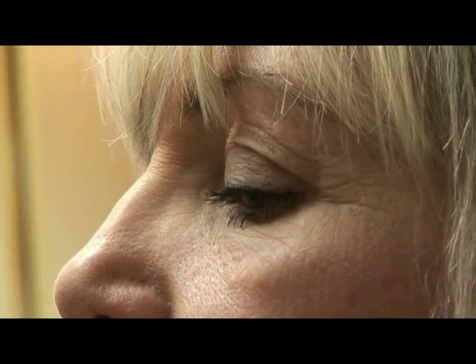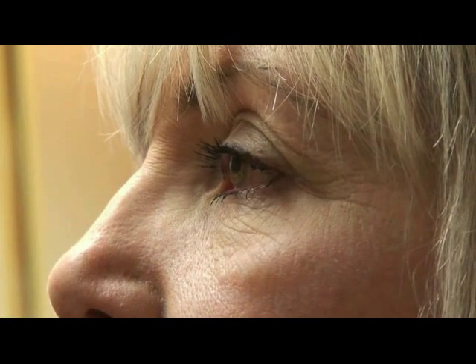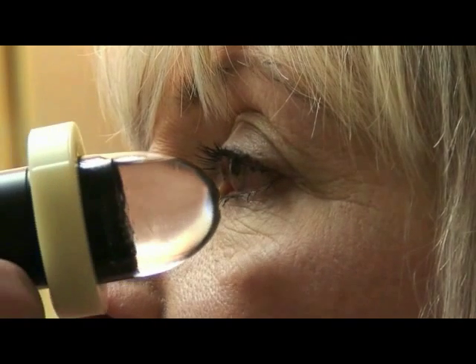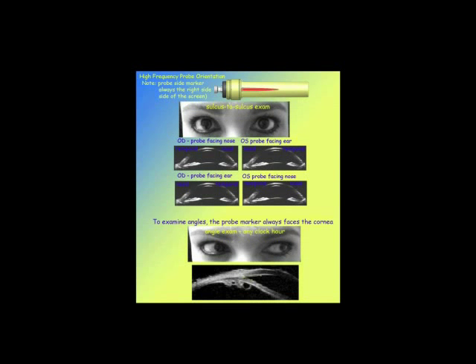When performing UBM examinations, have the patient sitting up in the same orientation that the eye care specialist would examine them. This should overcome problems in measurement accuracy, since ocular structures such as the iris and anterior chamber may be subject to gravitational changes when the patient is reclined. Knowledge of probe orientation is necessary to correctly label your echogram. The white line on the probe body indicates the direction of linear movement of the motorized element. For examining angles in the glaucoma patient, the line should always point toward the cornea regardless of clock hour, and the image will always show the sclera on the left and the anterior chamber on the right.